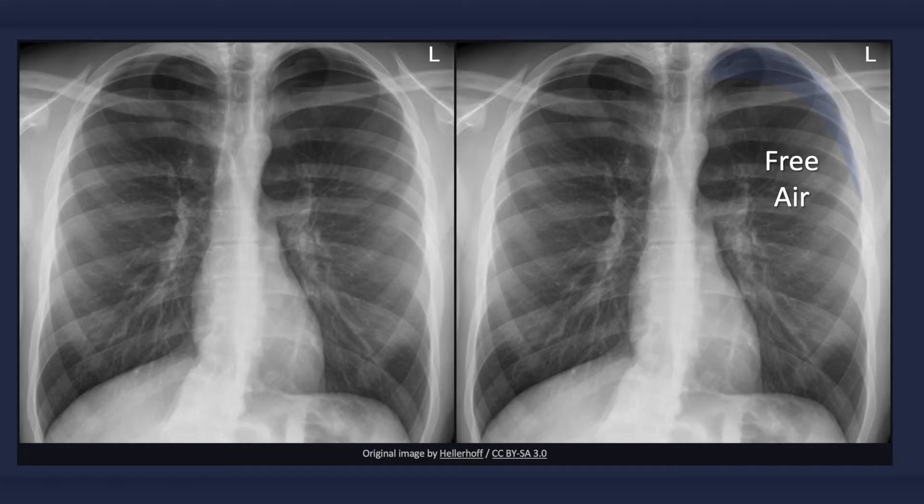Can you see a crescent of increased transradiency in this x-ray? You may need to look closely. This area of increased blackness represents free air. Notice the lack of bronchovascular markings within this region.